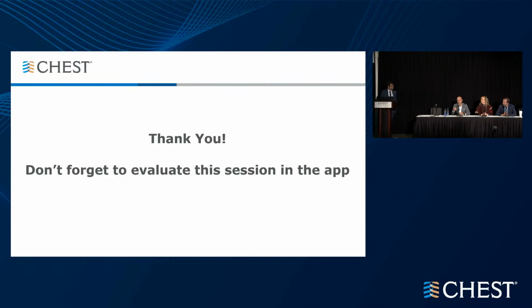Many of you were probably in Dr. Rigsman's session, and I don't know if this was covered because I missed it, sorry. On the molecular thing, talk to your lab, because honestly, we have no problem running it, and I promise you, it's not because of what I do. I put a needle in the node just like you do, and I do the same biopsies in the periphery of the lung. It's the amount of DNA that my molecular lab is requiring, which is in the range of 5 nanograms.